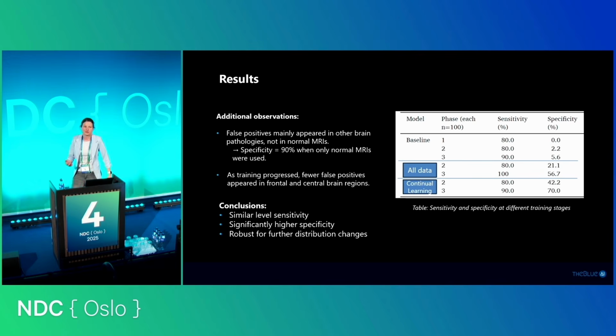If you think about it, if we really continued to train on real-life examples, meaning at the end there will be just 1% of MRI scans with FCDs, because the majority of the population doesn't have FCDs, at some point it will be a similar kind of problem as detecting anomalies, for example, in machines. The model would be likely to say there is non-FCD, and it will be right in 99% of the cases, because it's just adapting to the data distribution.